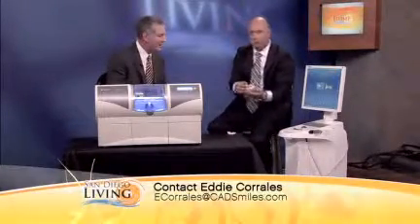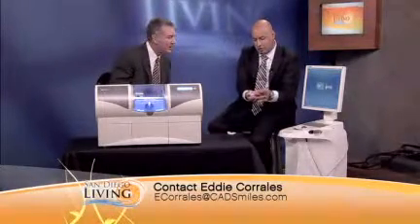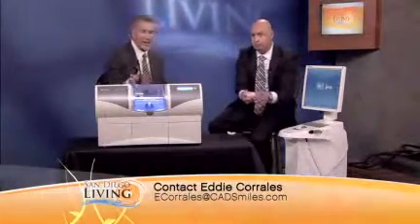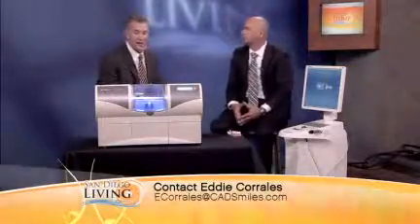And here's the final product. I don't know if you guys can see it in the camera, but this is after 10 minutes in the machine. Once it's done milling, it just fits perfectly in a patient's mouth. Right into the model, just like that. Folks, we're going to let that go ahead and mill, and maybe we'll take a look at the finished product a little bit later on, but it takes about 10 minutes per tooth.